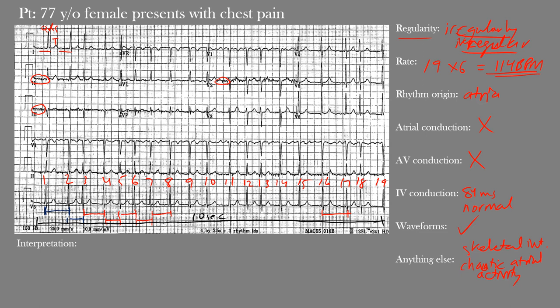So what is our interpretation? We have a fast, irregularly irregular rhythm with no clear, well-defined P waves along with normal intraventricular conduction. This is a case of atrial fibrillation with rapid ventricular response — AFib with RVR. It's rapid because the rate is above 100. It's AFib because we have no clear P waves and the rhythm is irregularly irregular. In conclusion, our 77-year-old female patient presenting with chest pain has an EKG showing AFib with RVR.